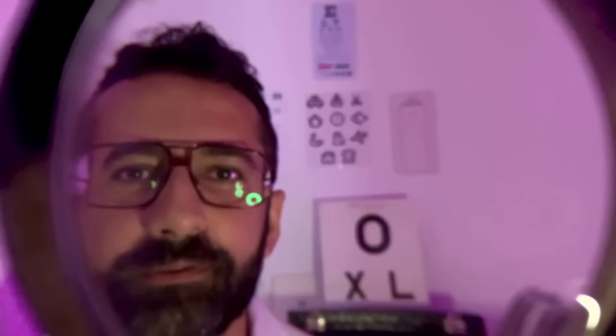We're going to move on to the portion of the eye exam where we try and improve your vision. This is your refraction test. We've had a few problems with the retinoscope, so retinoscopy is out of the question. We'll start from scratch, try to neutralize the prescription and focus the light on the retina, giving you the clearest vision possible. As you're looking over my shoulder at the chart at the top, what is the smallest row you can read for me please?